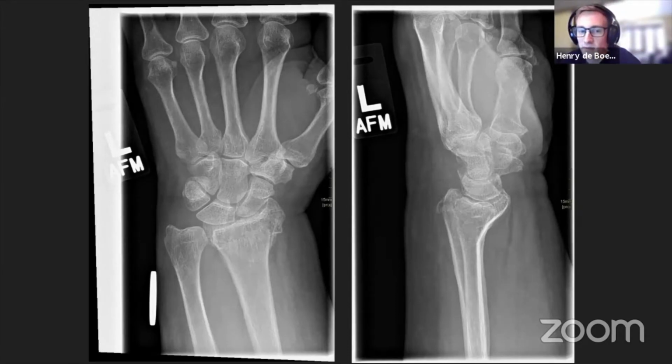And with these radiographs, the key, and what as radiologists we try and do, because certainly where we work in Sheffield, the A&E doctors or the nurse practitioners that work in our minor injuries or fracture clinics are very good at looking at these films, and they don't really miss very many injuries at all. But what we can add is sort of the slightly more descriptive reports. So if you see a fracture, try and describe how it's displaced, how it's angulated, where it extends from and to. Is it intra-articular? So does it involve the articular surface of the bone that you're looking at? And are there any other associated injuries?